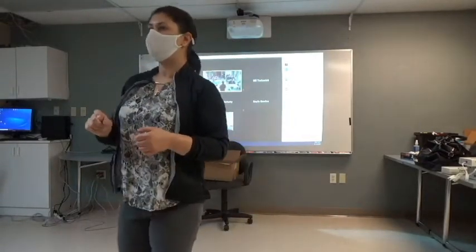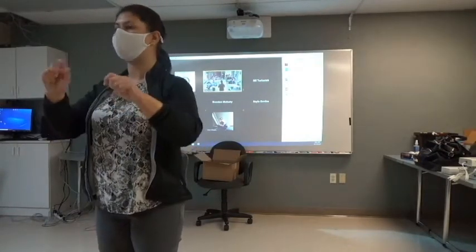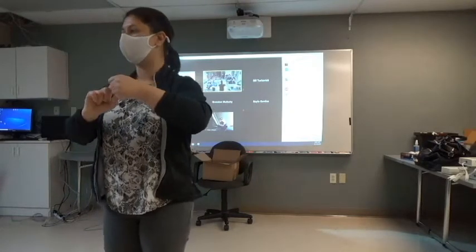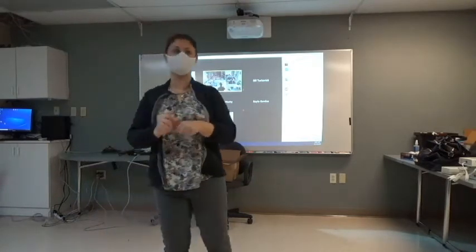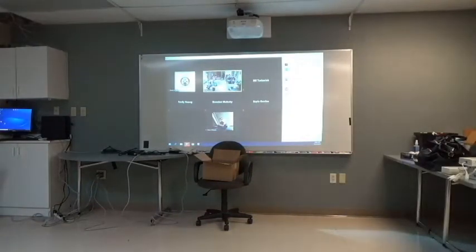You really only need one. So what we're going to do for now is we're going to find the blood pressure cuff and you're going to connect that pigtail together to the cable. So it's just a simple twist. No cuff? No.